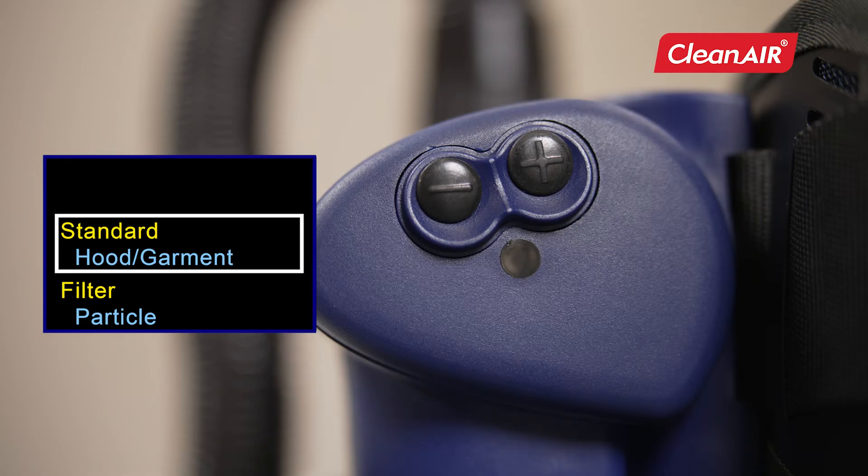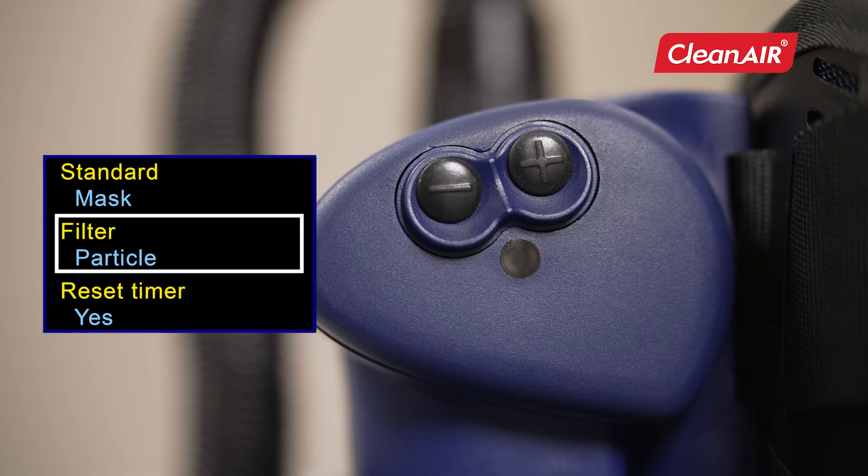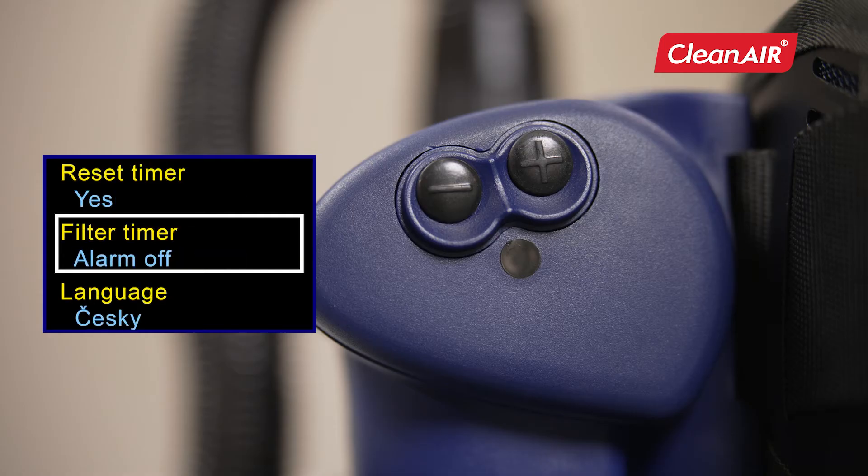In the standard section, you set the head top or suit that will be connected to the unit. In the filter section, you set the currently used filter type on the unit. By setting these parameters, the unit will automatically adjust the airflow. In the filter timer, you set the life of the filter and the unit monitors your timely replacement.